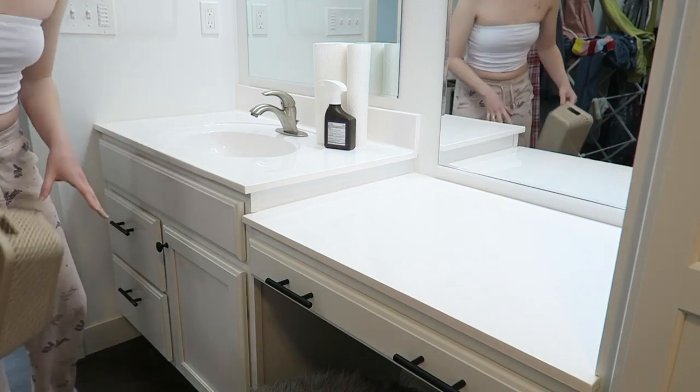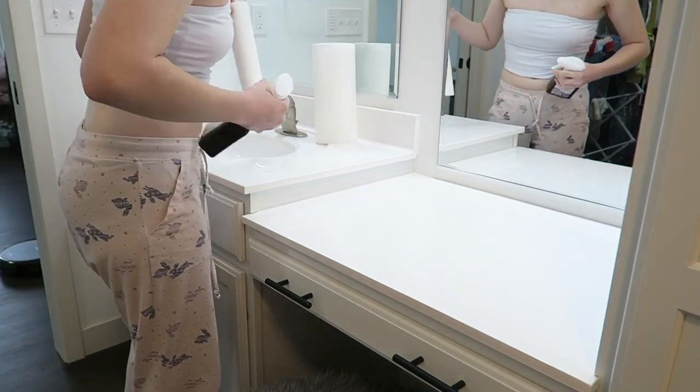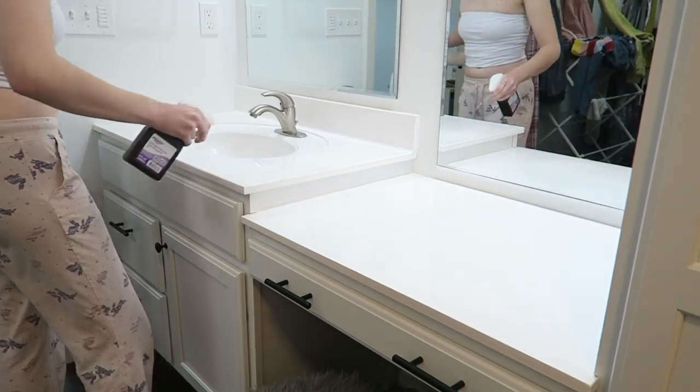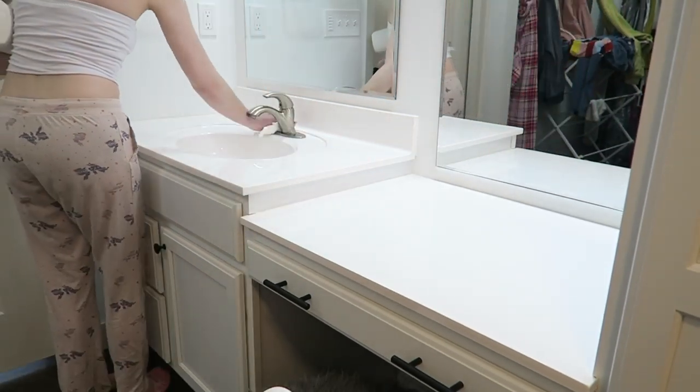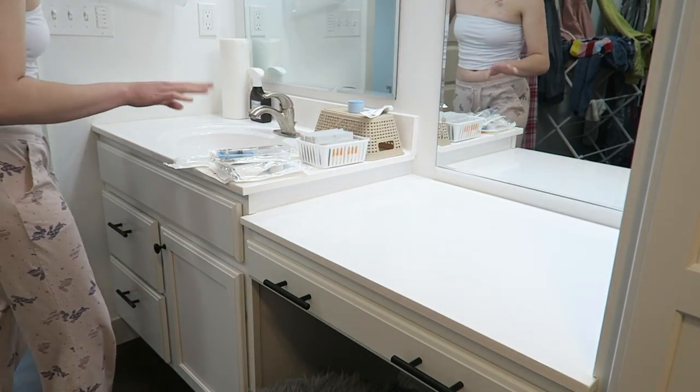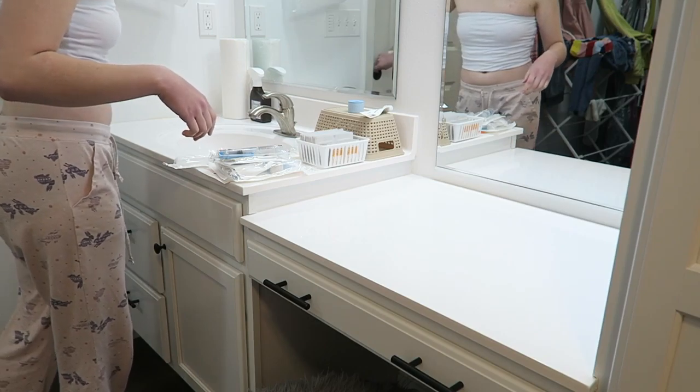So I'm actually going to wipe everything down one more time with peroxide, just very quickly, just to sanitize it. There we go. It's all nice and dry. All right, now that I have all my supplies in here, I'm actually just gonna go ahead and set them up in the order that I'm gonna use them.